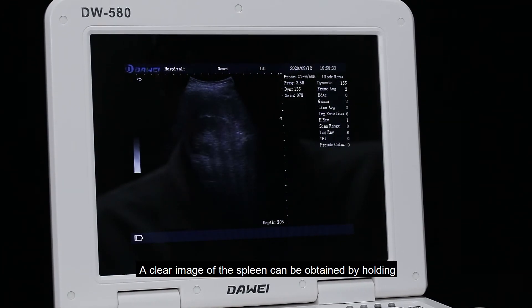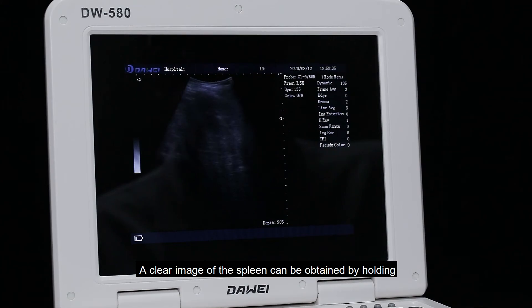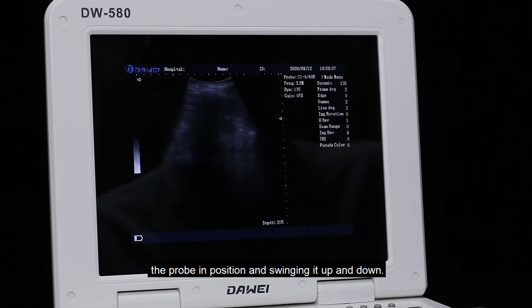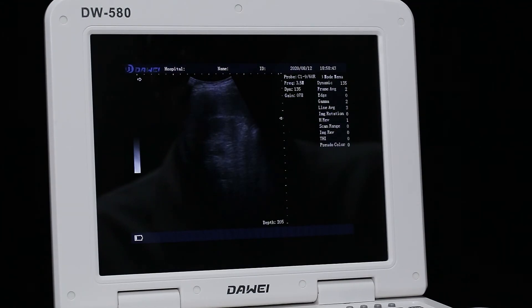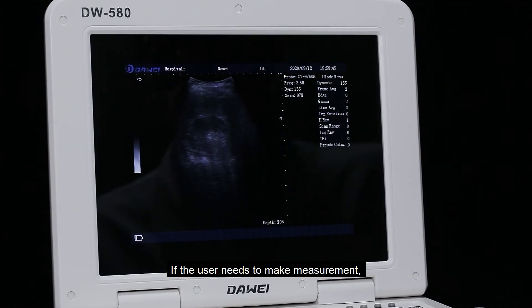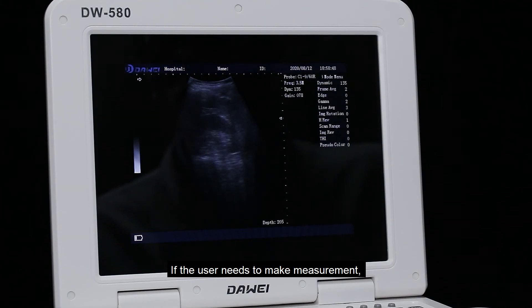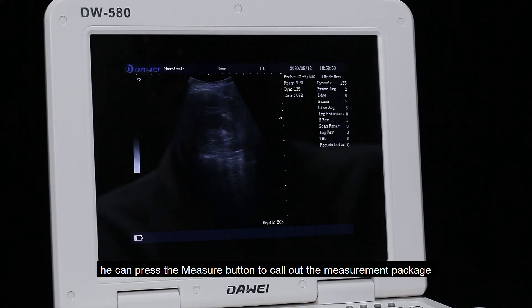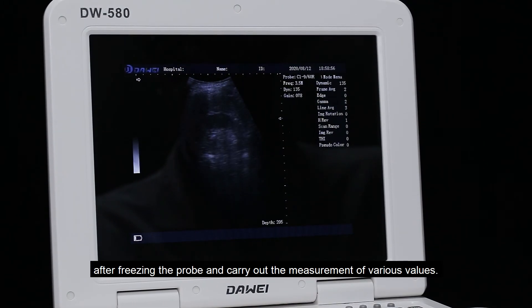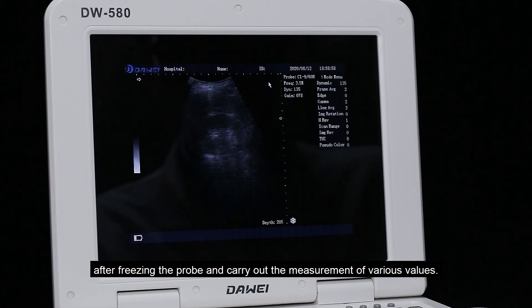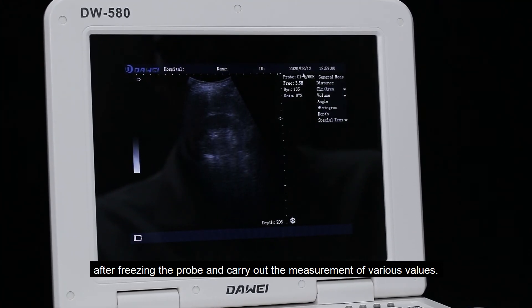A clear image of the spleen can be obtained by holding the probe in position and swinging it up and down. If the user needs to make a measurement, press the measure button to call out the measurement package after freezing the probe, and carry out the measurement of various values.